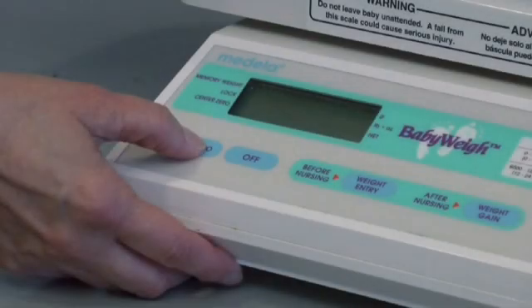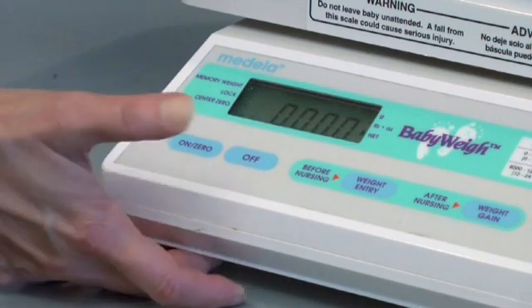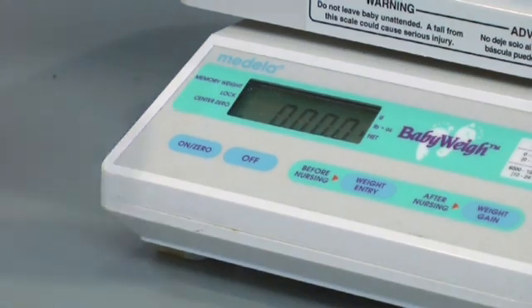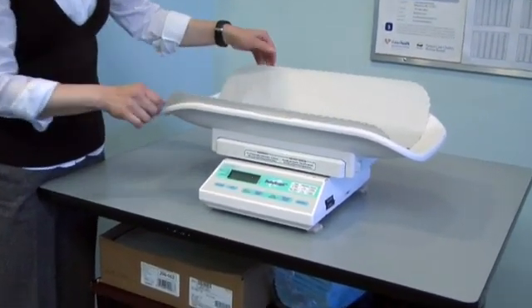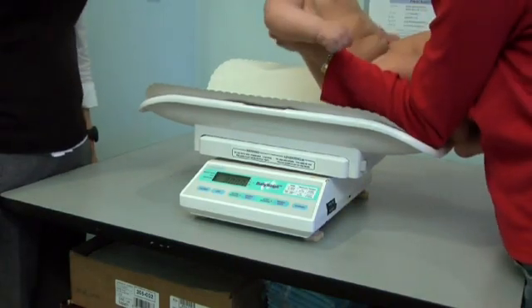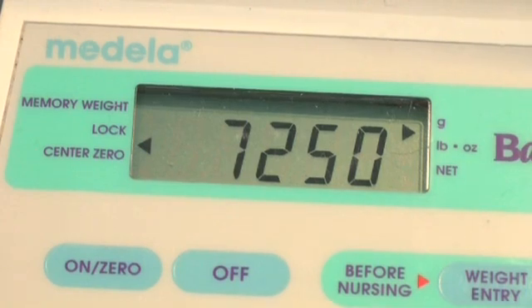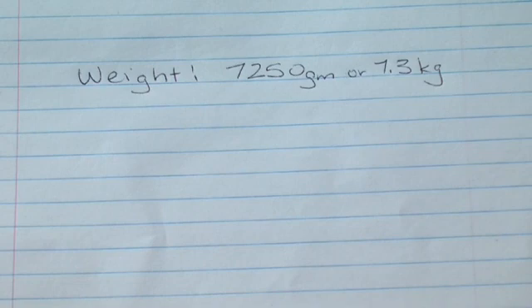For weighing infants under 2 years, the scale should be accurate and reliable, with a maximum weight of 20kg in 1 or 10g increments, easily zeroed and recently calibrated. An average weight feature is desirable on an electronic scale to accommodate infants who do not remain still during weight taking. The infant should be weighed nude in a warm room, ideally before a feeding. Weight should be recorded to the nearest 0.1kg.